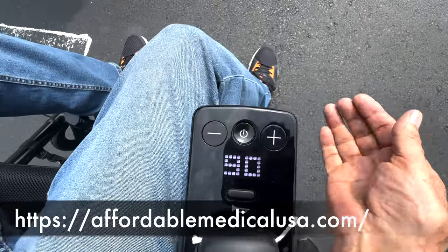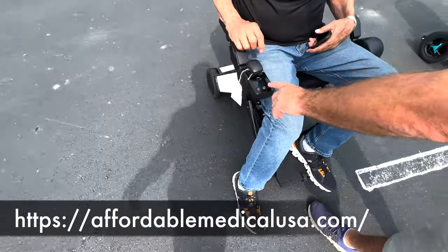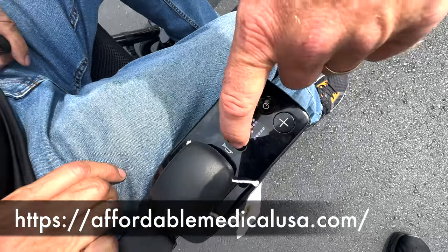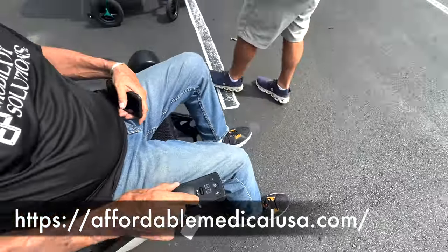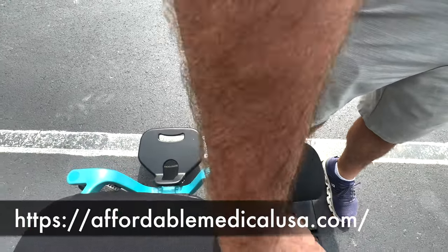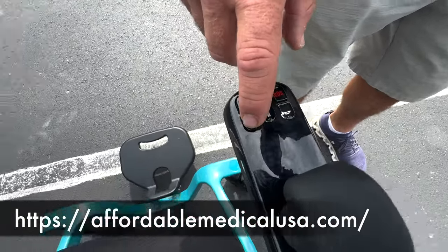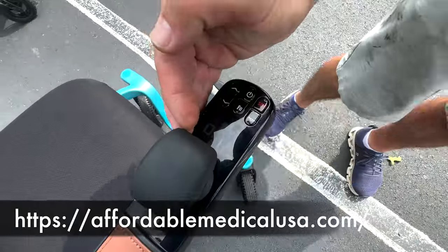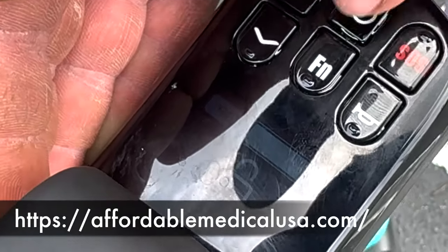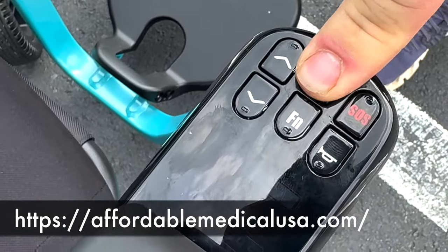Move your hand, Eddie. No, he's good. Horn. Oh, button. Speed control. Slower. Faster. Power button's here. Horn's right here. Over here. They say don't put your hand on this to get up, so put your hands back here to get up. This one makes noise, but you can turn it down. That's your speed. This is your horn. That's just an SOS button. That's your power on, power off, but you gotta unlock it to turn it off. So you gotta hold this, turn it on and off, which you might like, you might not like.